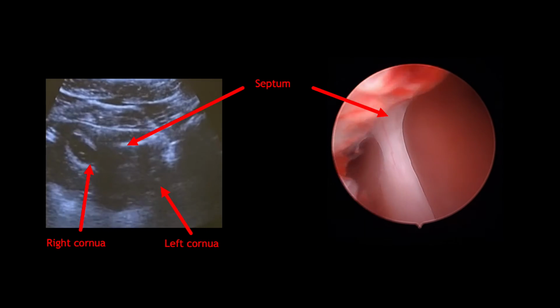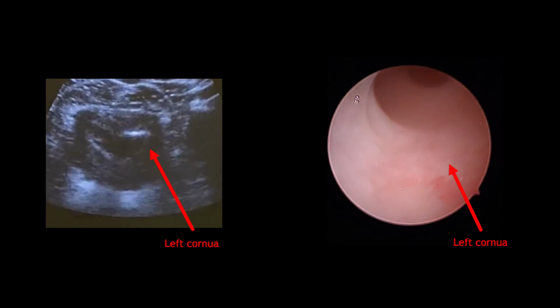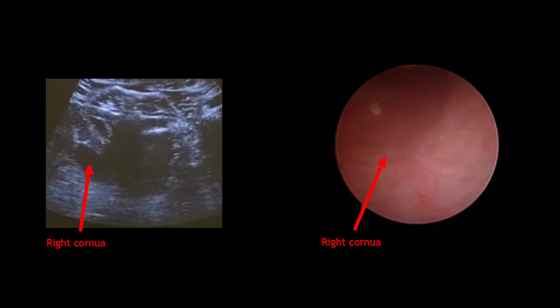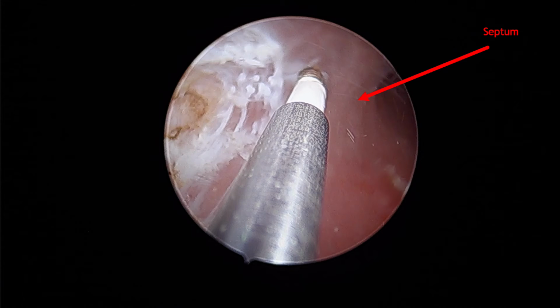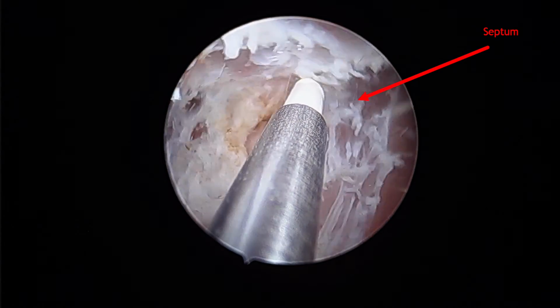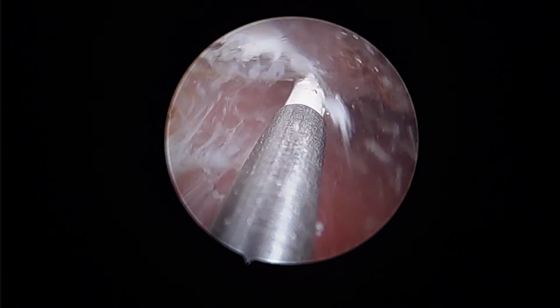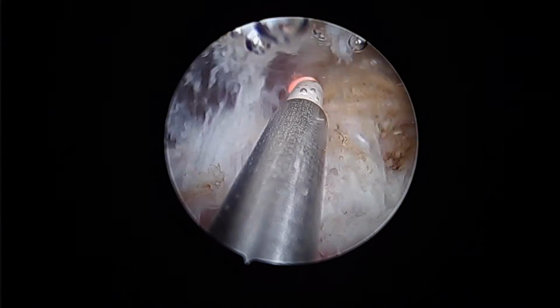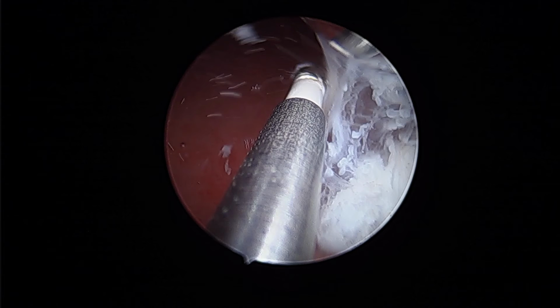A 2.9 mm operative hysteroscope with a 30-degree lens was selected. Dilation was not necessary to enter the cervical os. Hydrodistension with normal saline was utilized to expand the endometrial cavity for better visualization. The Gynecare VersaPoint bipolar electrosurgery unit with twizzle tip was utilized with settings of Vapor Cut 100 and Desiccate 50. Resection of the septum was performed using a side-to-side sweeping motion with short bursts of energy to vaporize the tissue.